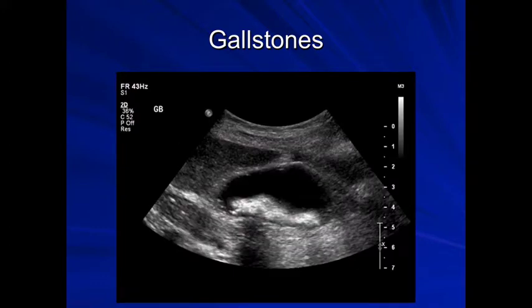If we look, here is another example. Here we have gallbladder. Here we've got echogenic mass, and there's definitely some shadowing here. This again probably represents other stones, and as we sweep through we'll probably pick up the shadowing from those stones as the beam is centered directly onto the stone.